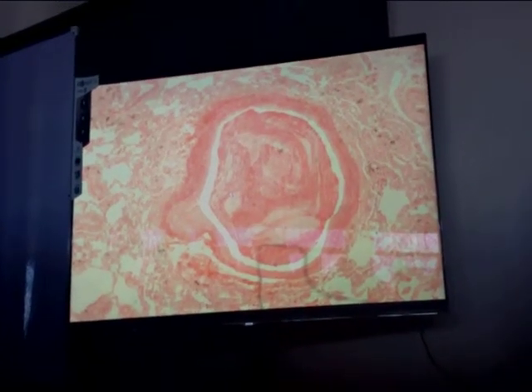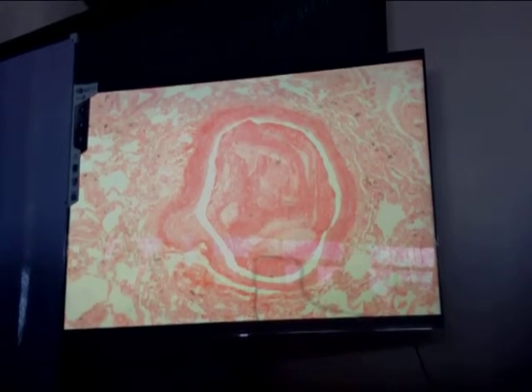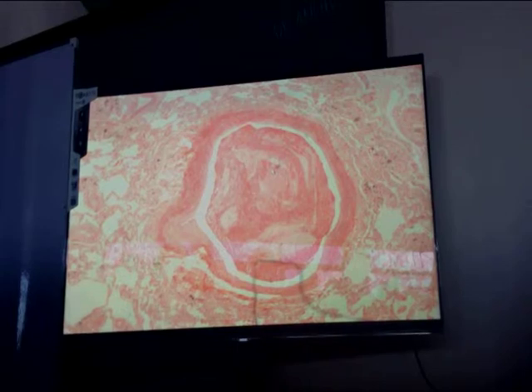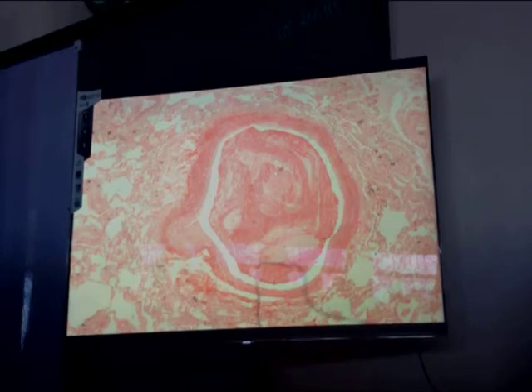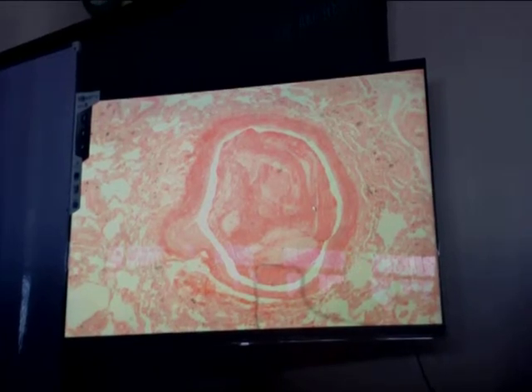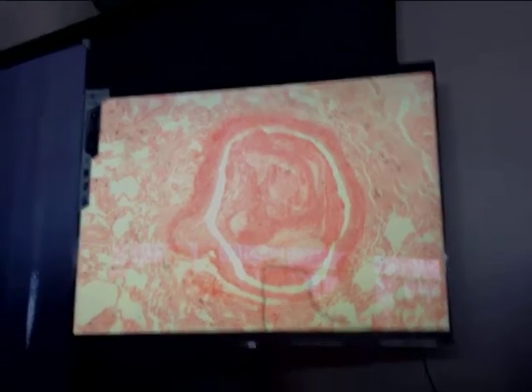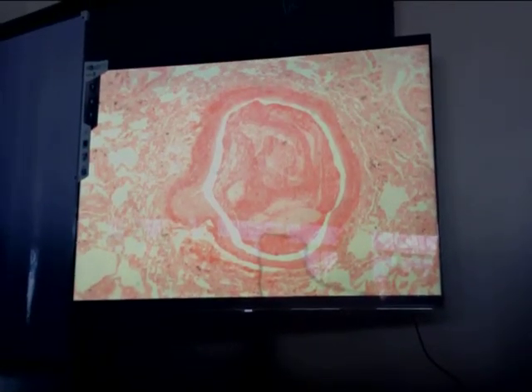That is the problem of that lung. That is a blood vessel and it is almost completely obstructed by an embolus. How will you differentiate an embolus from a thrombus? Will you be able to see attachment of the obstructing material in a thrombus or in an embolus? Thrombus. Here, it is not attached. However, it has caused marked obstruction or marked decrease in blood flow already.